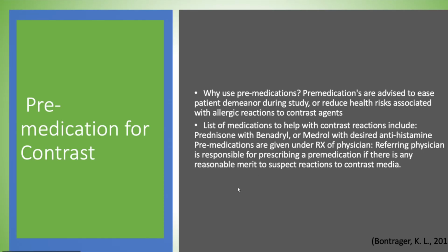Let's keep moving forward. Pre-medications for contrast, like I was just talking about. Pre-medications are advised for patients who maybe have tendencies to act up during studies. Some patients rarely will be prescribed something to calm them down because they don't do well in enclosed spaces. That's not unheard of. There's also some health risk associated with the contrast, and so if we have any reason to believe that the patient might have an allergic reaction, we might just give them preemptively some antihistamines, maybe Benadryl, anything to kind of alleviate the symptoms of the contrast affecting the patient.